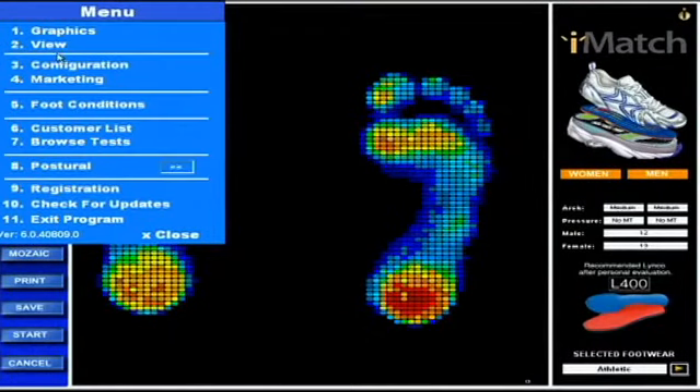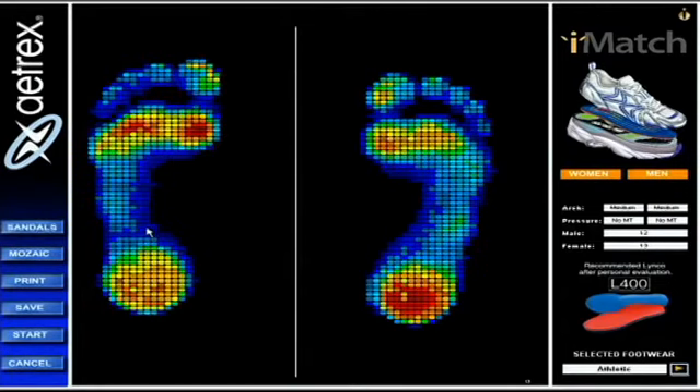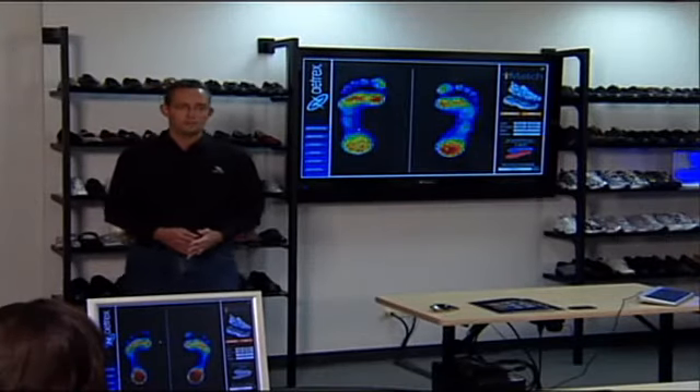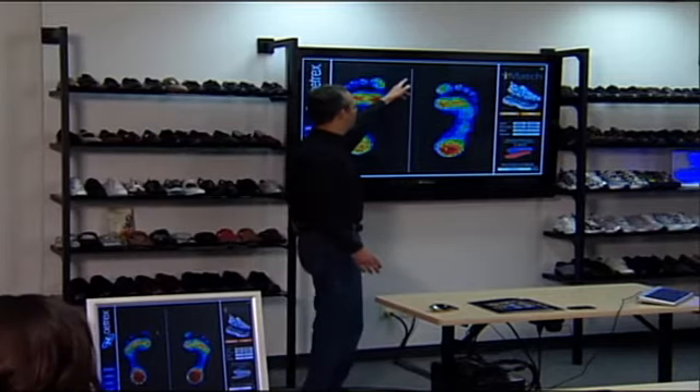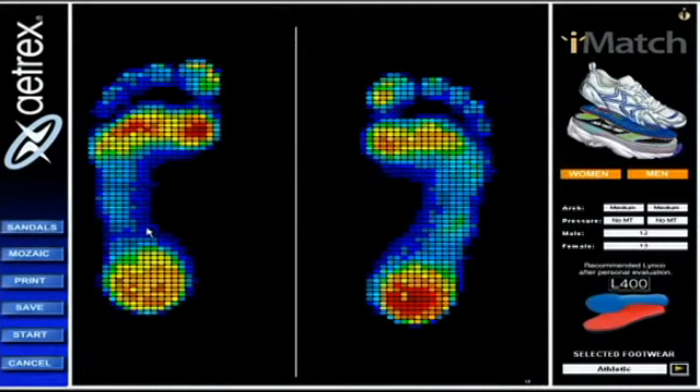Let's go back to number two — we just went through number one. Number two is View. Let's click on that and jump to Steve's question about the third thing here: the median line. Isn't it good to have a line down the middle? I think it's helpful. This is one of the options in View that I would recommend using, and just by clicking on that you can see we have a white line down the middle of the i-Step test.